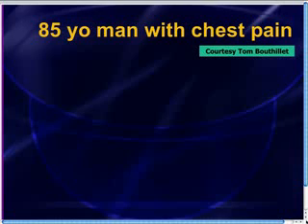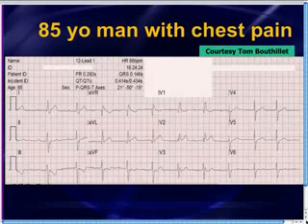The last time he sent us a case that we used was back in March earlier this year. It was one of the DeWinter T-Wave cases. So thanks for that, Tom. And he is a captain and a paramedic in the Hilton Head Fire and Rescue, and he is somewhat of a self-confessed EKG nerd himself, so I have the highest level of regard for people who are willing to admit that. Anyway, this is the case that he sent.